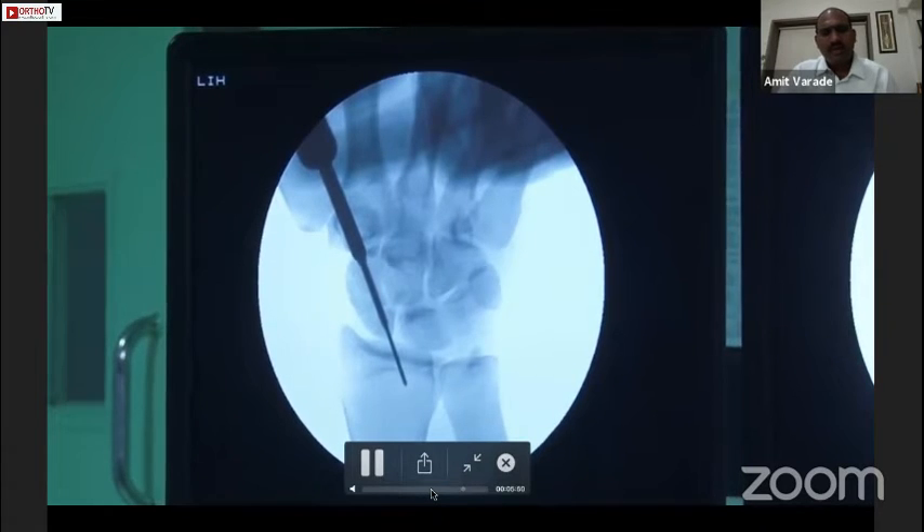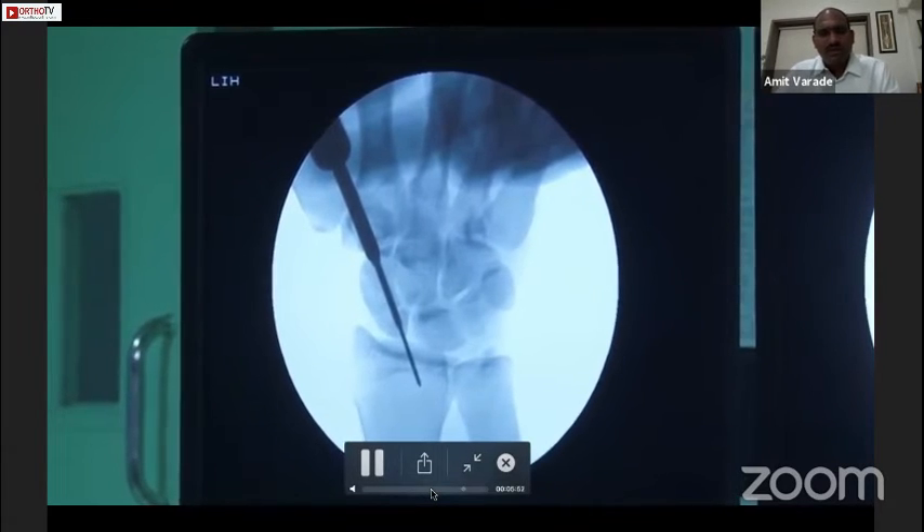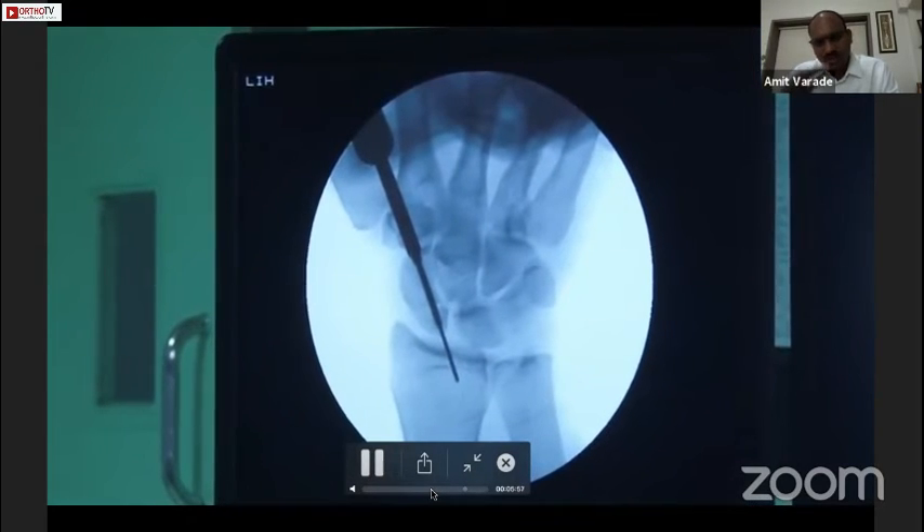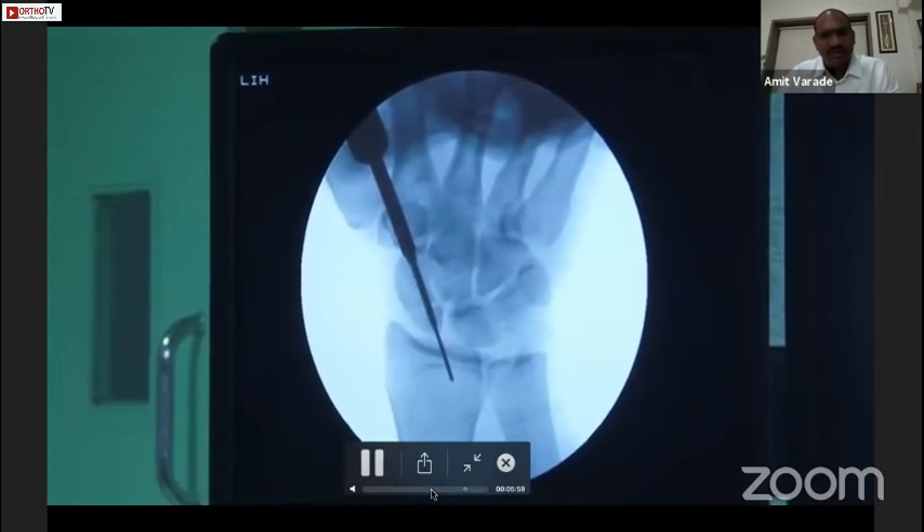At this stage, if we look at the screwdriver we can see the red mark, which means the screw is totally inside the bone.